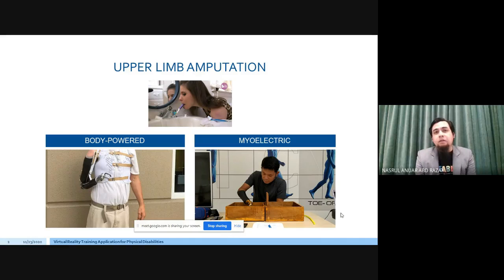The first one is the cosmetic prosthetic. The cosmetic prosthetic is usually static. It doesn't conduct any movement. It is just cosmetically well made, of rubber. The second device is known as a body-powered prosthesis. As you can see from the figure, it allows body movement to be transferred from one section to another. You use the harness on your shoulder in order to move your arm, your elbow, etc. So this is known as a body-powered prosthesis.